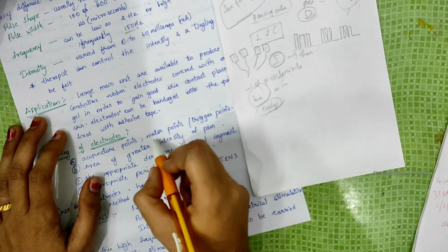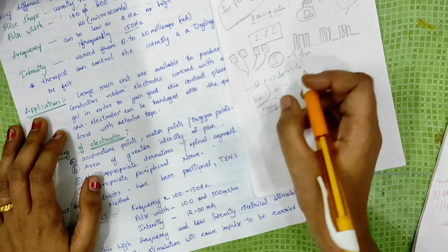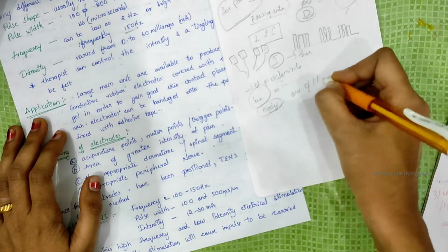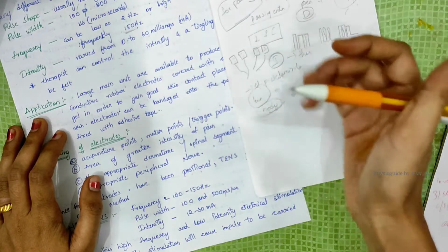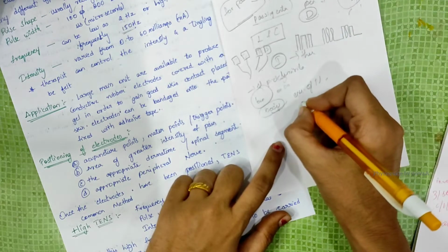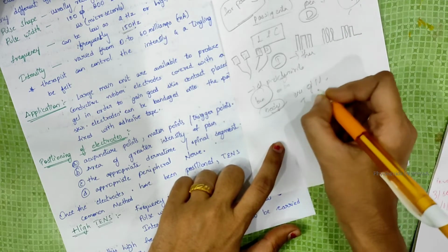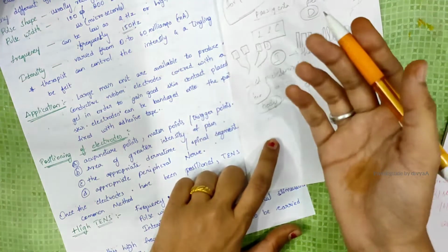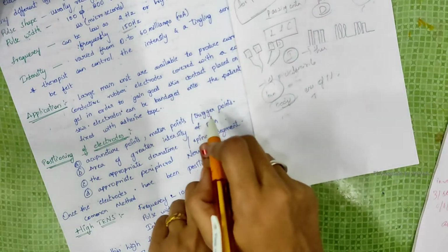And motor points means points with higher excitability of muscle. If we give minimum intensity, the excitability will be more; those points are called motor points. And the other main points are trigger points.